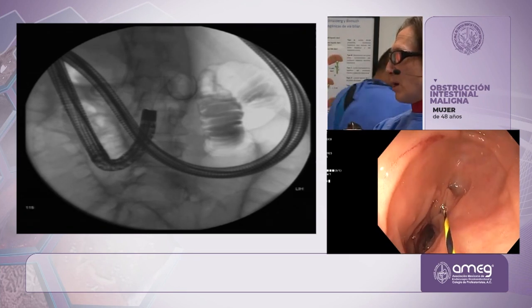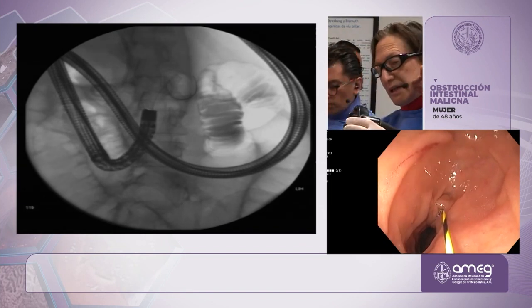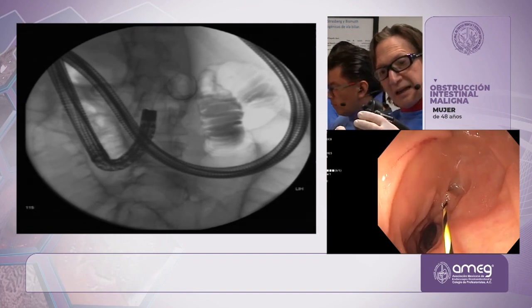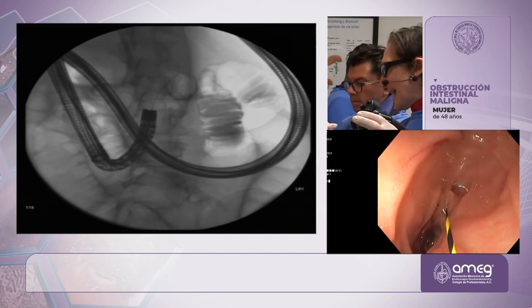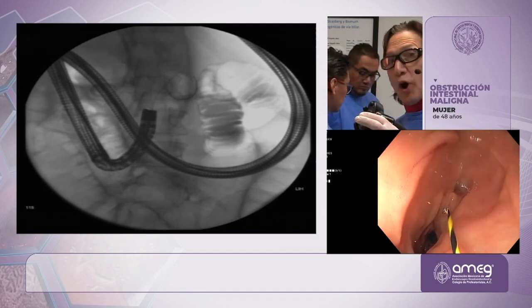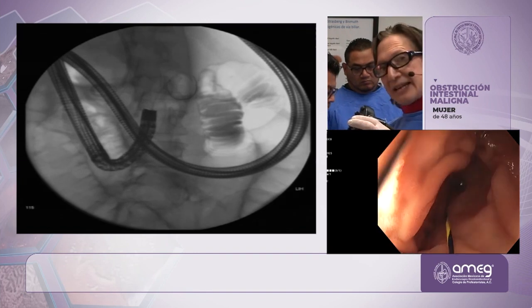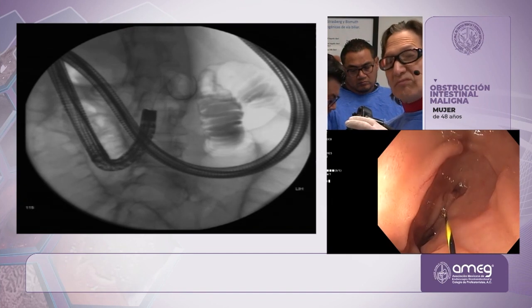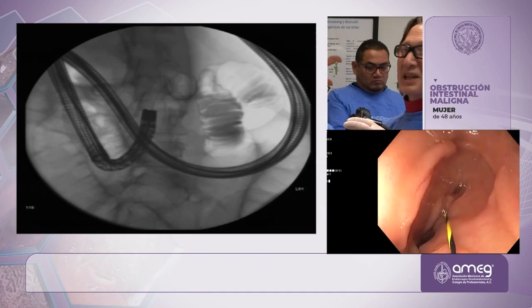As soon as I'm out, and I'm out now, I am going to now lock the position of my guide wire. And I'm holding it with my little pinky finger here. And now Miguel is inserting the oral enteric catheter, the OEC, over the guide wire. And we're going to advance that now under vision into the distal duodenum / proximal jejunum.